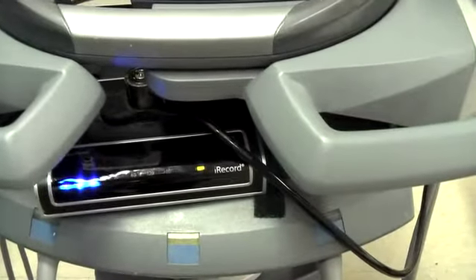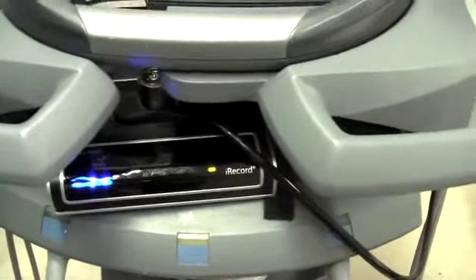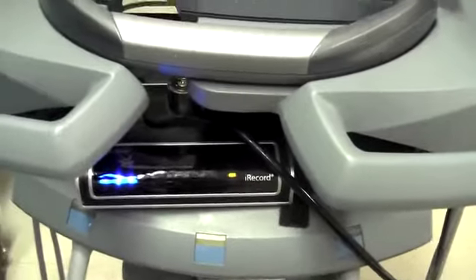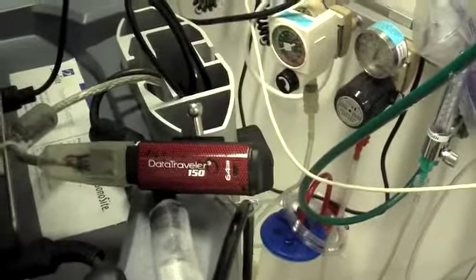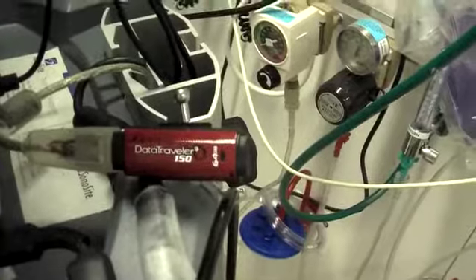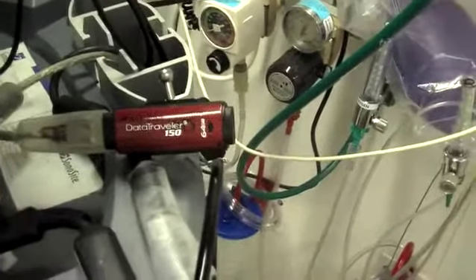What happens when it's full? Oh, I'm glad you're asking me that. If you look back here, this is the memory stick, the 64 gigabyte thumb drive that we have connected to it. On the off chance that this could fill up, or if it's not connected properly, for example, if this S-video cable back here is not all the way plugged in, see how this can come out of the S-video port? You have to plug that back in there.